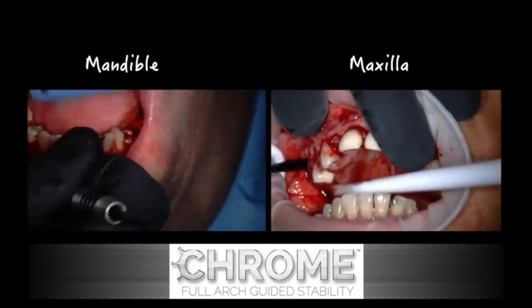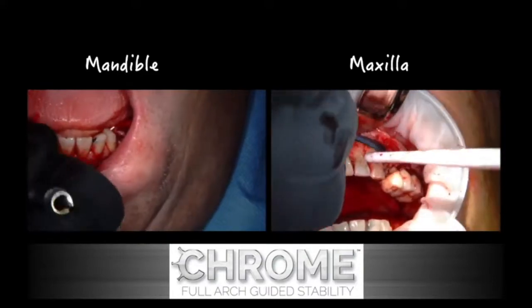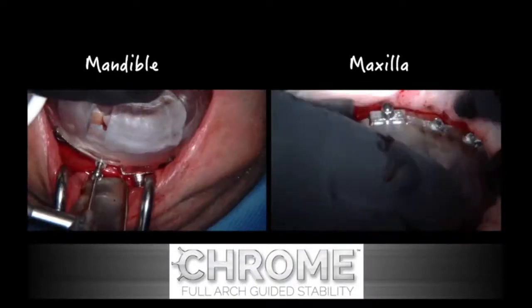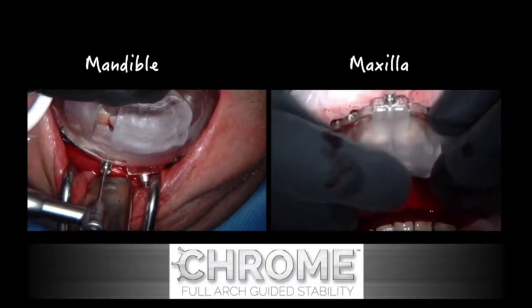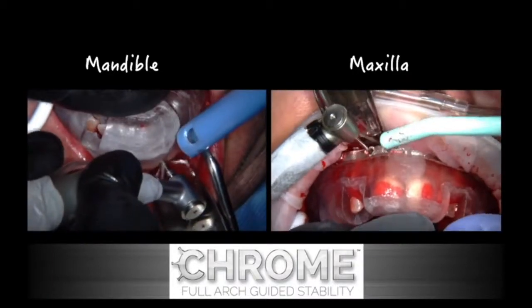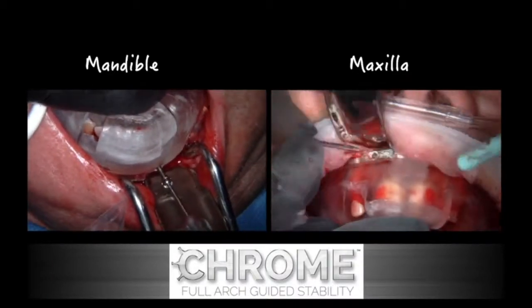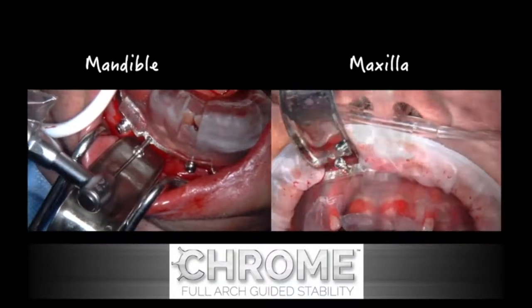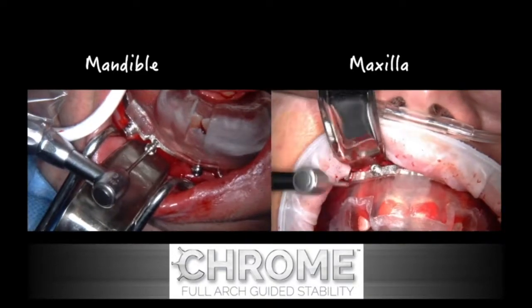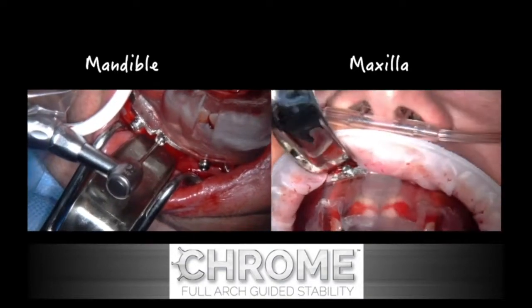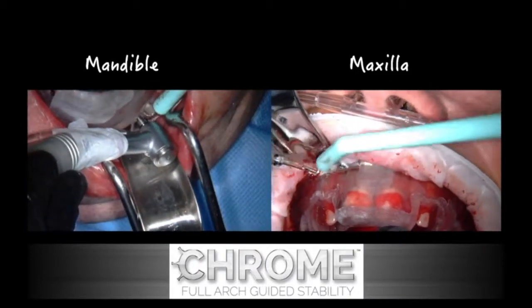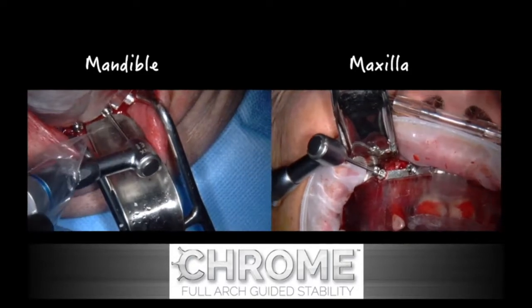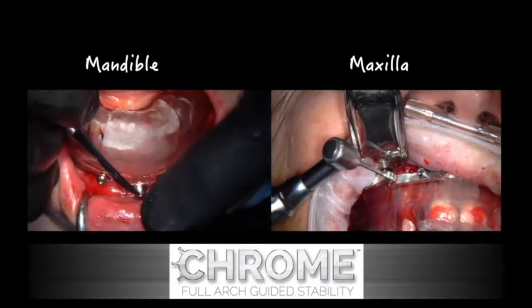Here's Dr. Towell addressing this particular case, first doing a flap that is necessary to be able to seat the chrome guide properly. This will go over the teeth. Each part of the foundation is then fixated with our fixation pins, as you can see here, on both the mandible and the maxilla. It's very important that this process be done carefully, because this process is going to dictate everything else that occurs from the positioning of the guide forward, as everything is based upon the position of this foundation guide.